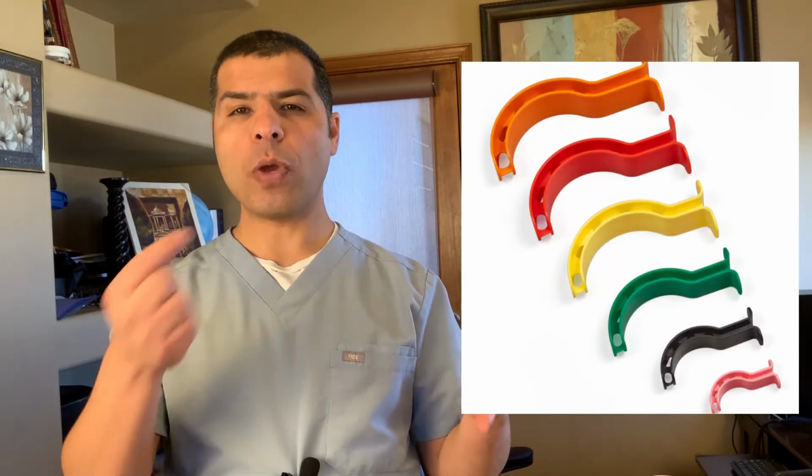I usually insert, or I tell my respiratory therapist to insert, an oral airway right away. Now some people decide to put in oral airways as soon as they are sedated, and that's perfectly fine, you don't have to worry about this complication. But in case you don't see a good chest rise, the oxygen saturation is dropping, make sure you open their airway and put in an oral airway immediately.